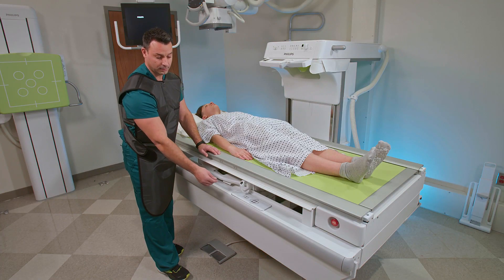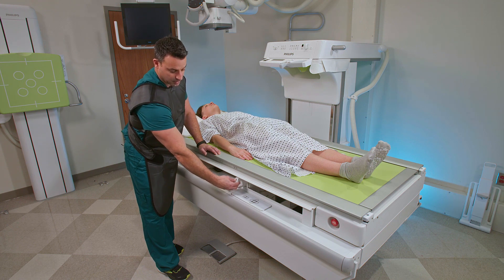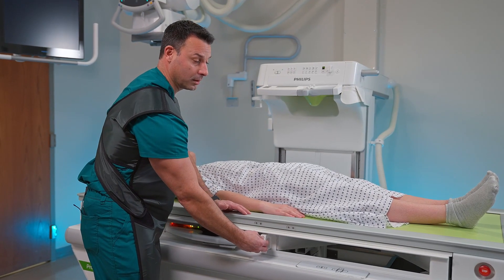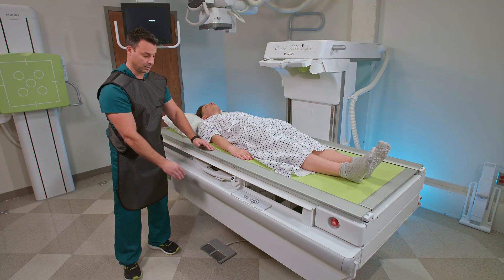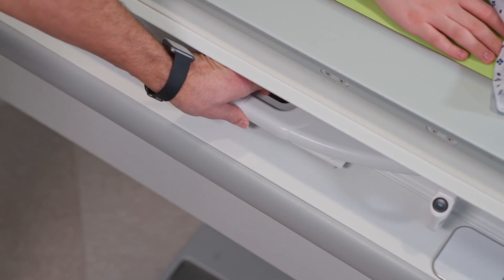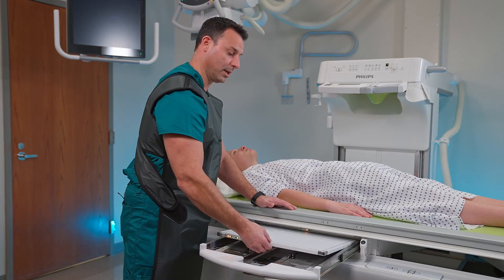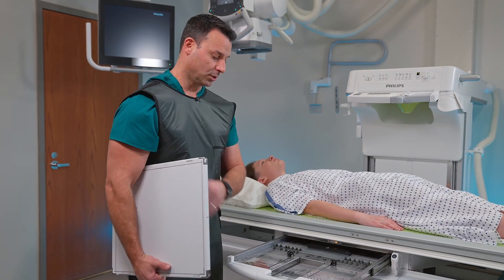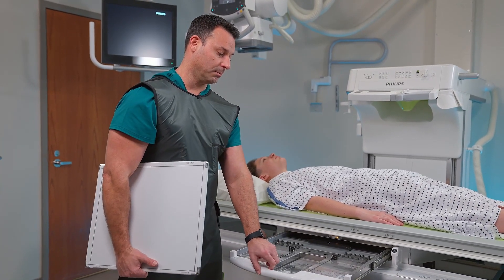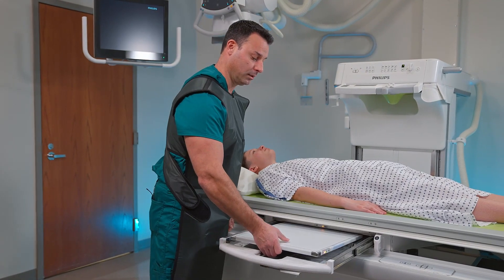I'm going to show you the table bucky. To move it, all you have to do is push in this button to move your table bucky up and down the table. To access your detector, grab the table bucky, release the lock, and you can pull out the sky plate, which is our wireless detector. Once you have the detector out, the bucky is locked so you can easily load the wireless detector one-handed.